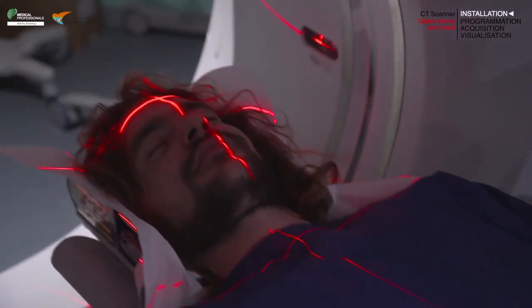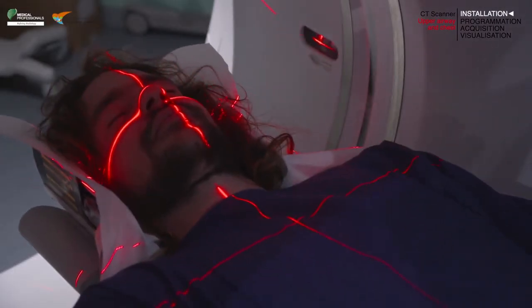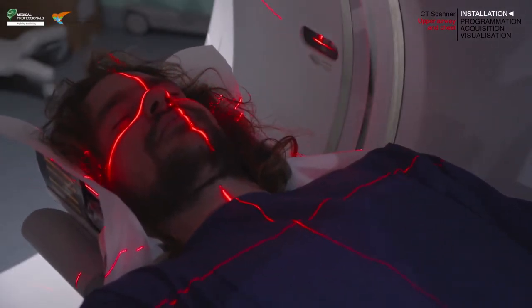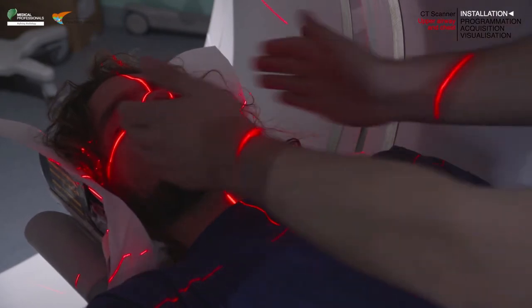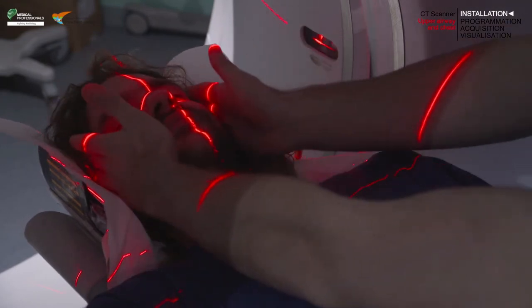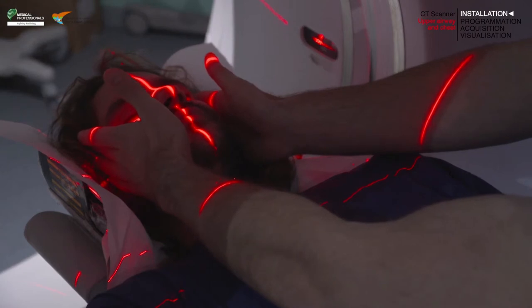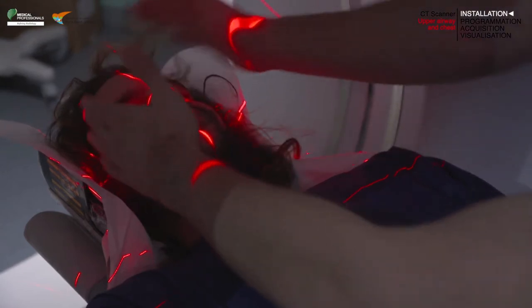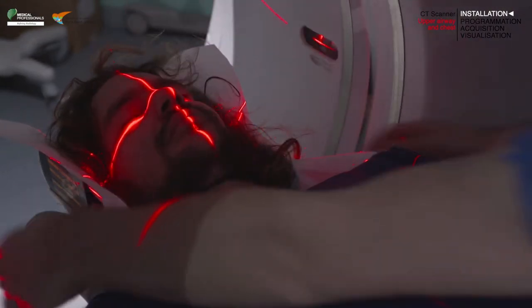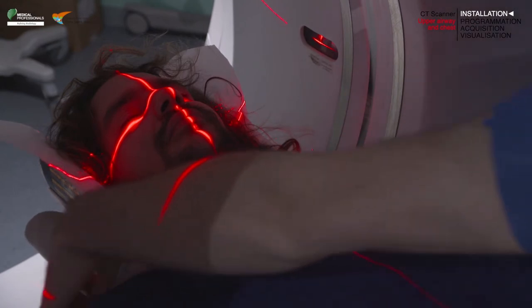Align the central ray to the level of the external auditory meatus using the internal axial laser light. Make sure that the lateral laser light is at the mid-thickness of the cervicothoracic region and that the longitudinal laser light is placed on the median sagittal plane.